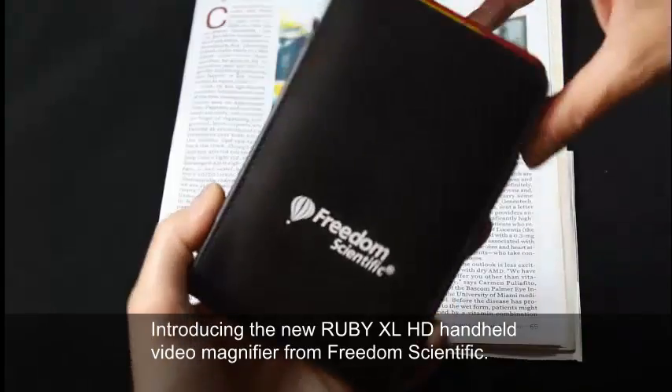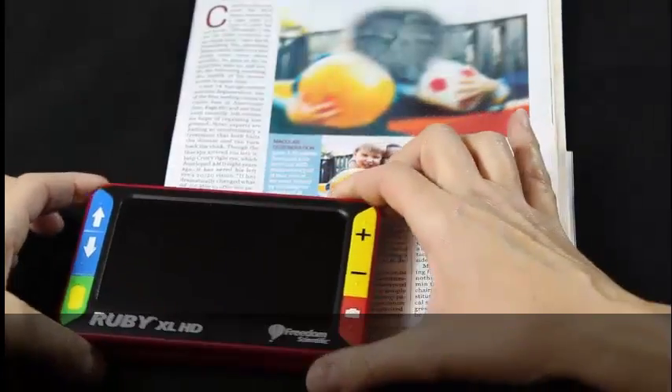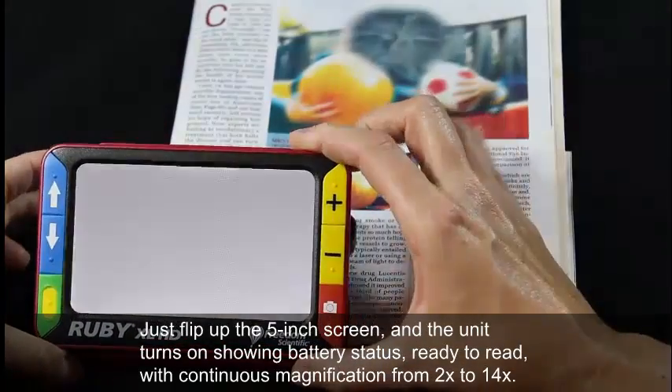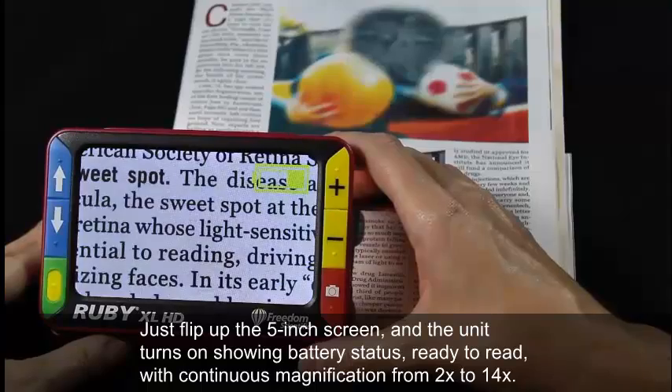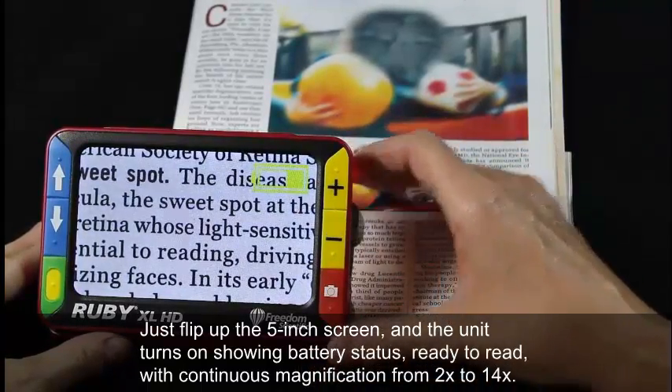Introducing the new Ruby XL HD handheld video magnifier from Freedom Scientific. Just flip up the 5-inch screen and the unit turns on, showing battery status — ready to read with continuous magnification from 2x to 14x.